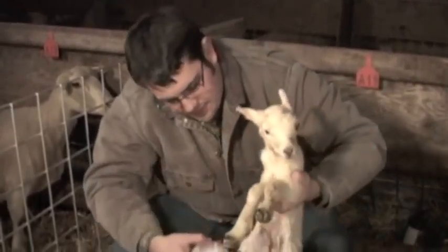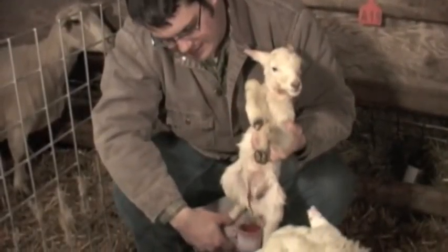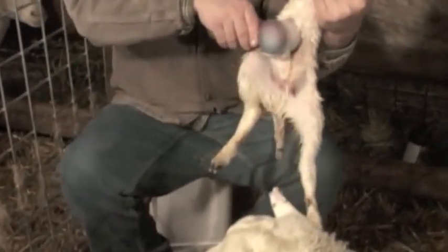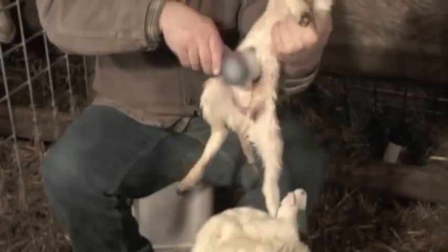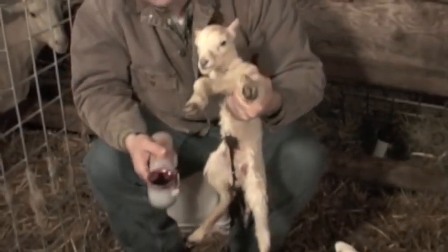So to dip a navel, take your cup, easy lamb, insert the navel, tip the cup, make sure it gets a good dose of iodine — and that's it.